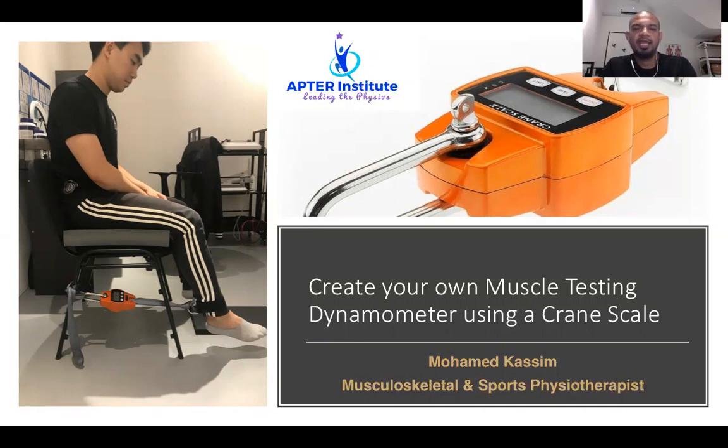Hi, this is MK and today's video is about creating your own muscle testing dynamometer using a crane scale. We as physiotherapists universally use manual muscle testing to determine muscle strength and weakness in our patients.